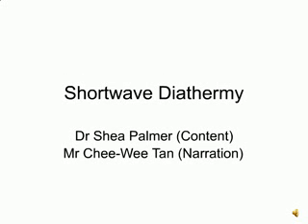Welcome to the narrated lecture on shortwave diathermy. Shortwave diathermy is the only method of achieving truly deep heating within the body. It has, however, become unfashionable in recent years, partly due to health concerns of therapists themselves.